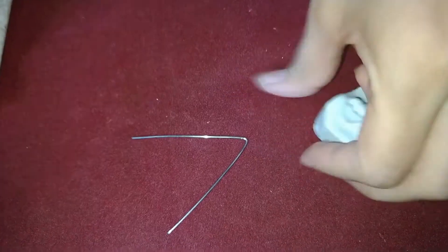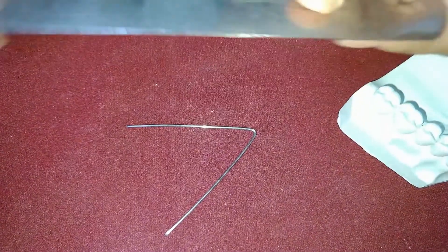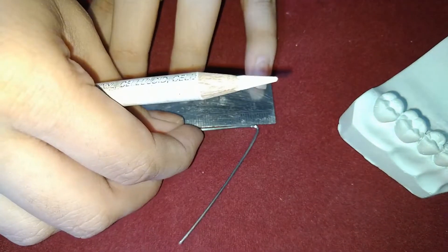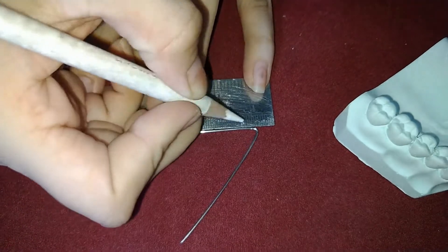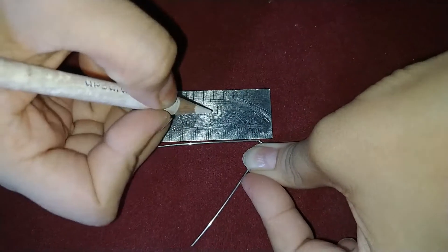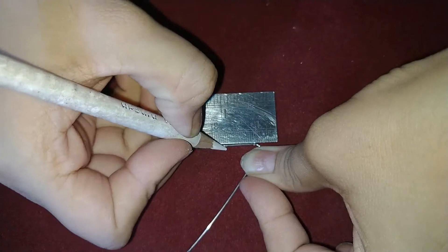Now we will mark two points on the arm of this V. The first point will be at 1.5 cm and the second point will be at 1 cm, making the ratio 3 to 2.